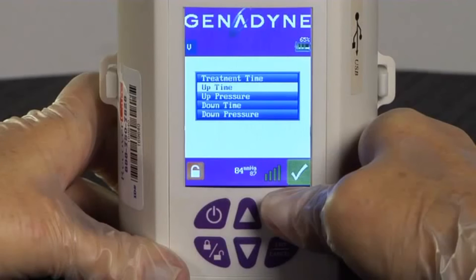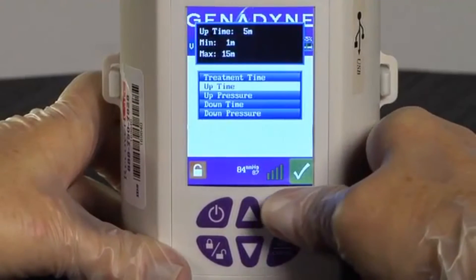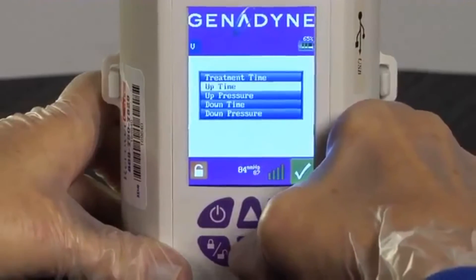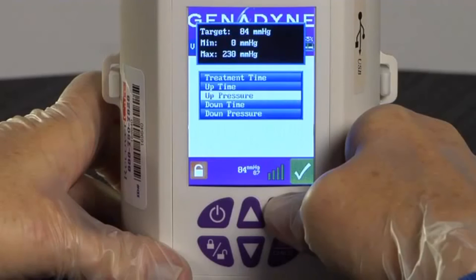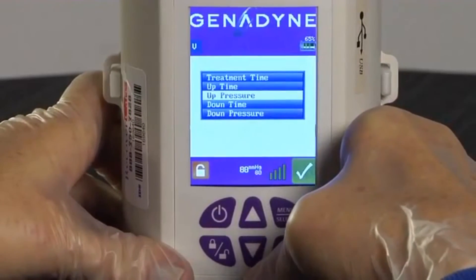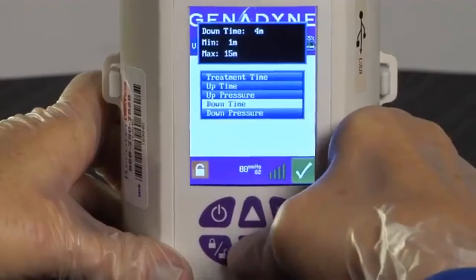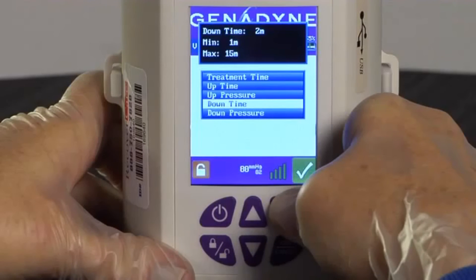Next, use the Up or Down button to select the up time on the menu. The up time is the time the pump will draw at a higher pressure setting. Press the Menu Select button again and, using the Up and Down arrows, set the time required for the pump to draw at the higher pressure. Press Menu Select to confirm the time and scroll to the Up Pressure on the menu. Press Menu Select again to set the up pressure. Use the Up or Down arrows to set the up pressure to negative 80 millimeters of mercury. The pump is now programmed to draw at negative 80 mmHg for 5 minutes during the up pressure cycle.